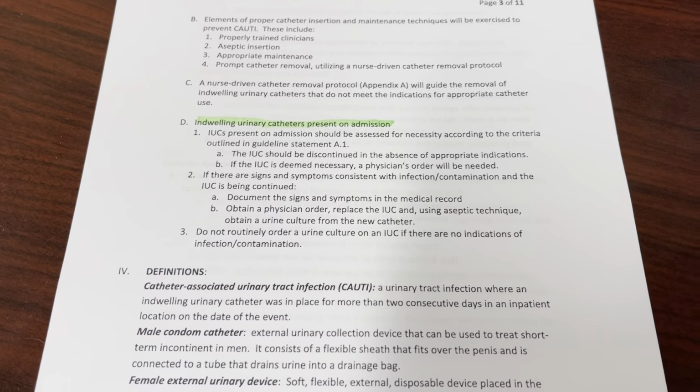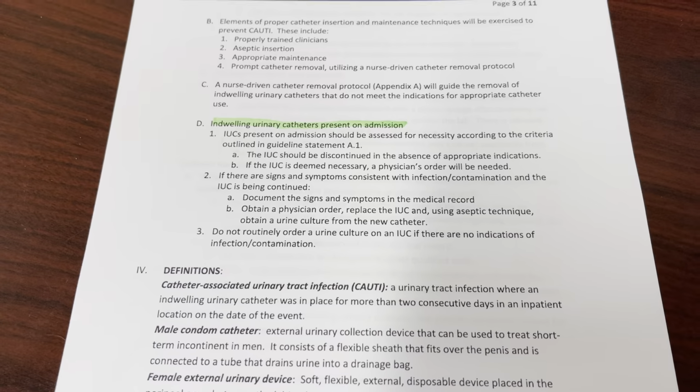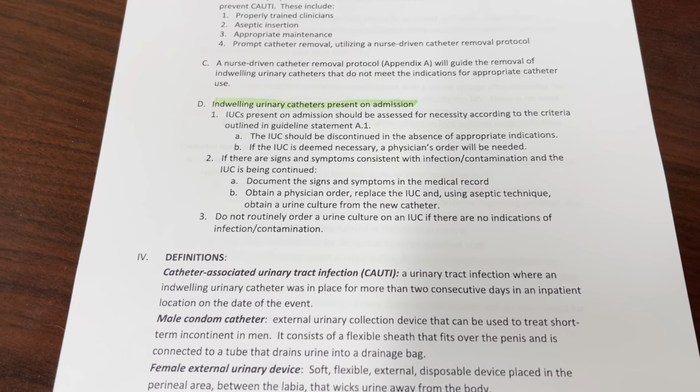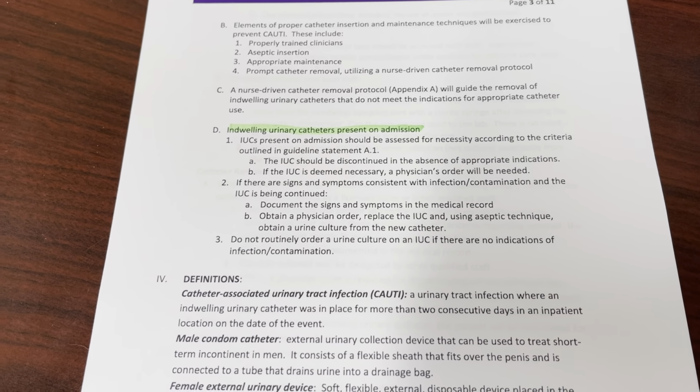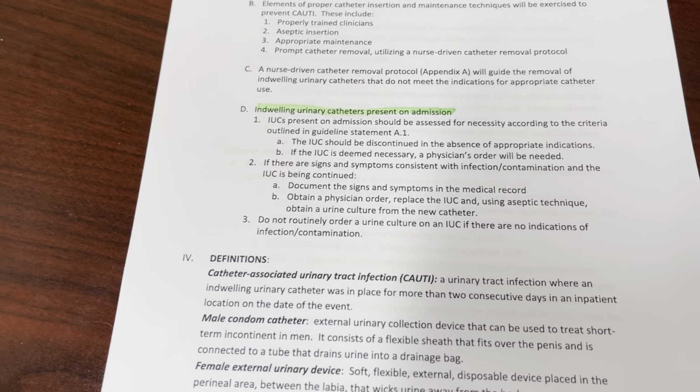If they need to maintain that catheter, so if it's like a chronic Foley catheter or if it's post-surgical for urology, we need to make sure that we get an order from our physician to maintain that catheter and have it documented in Epic. If the patient has a chronic catheter in place, then we need to get an order to change out that catheter.